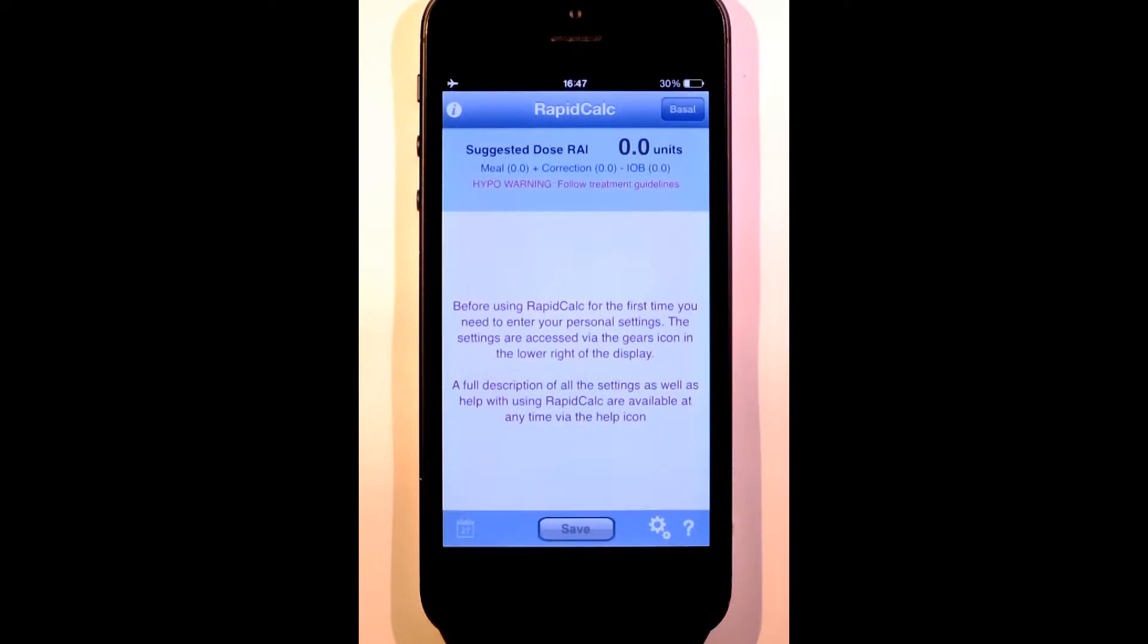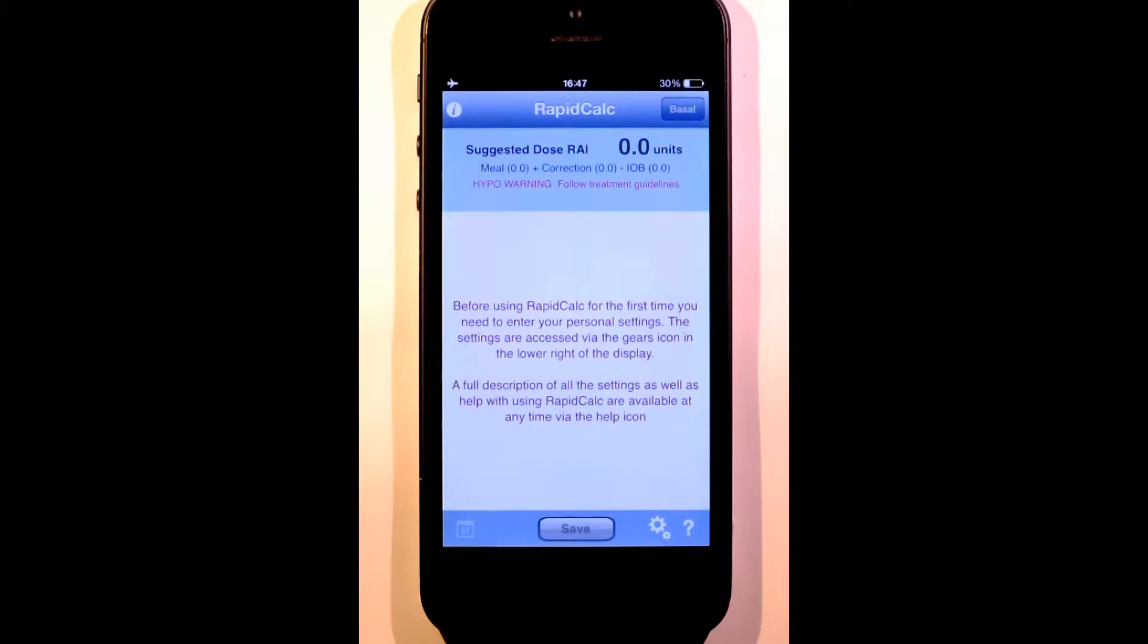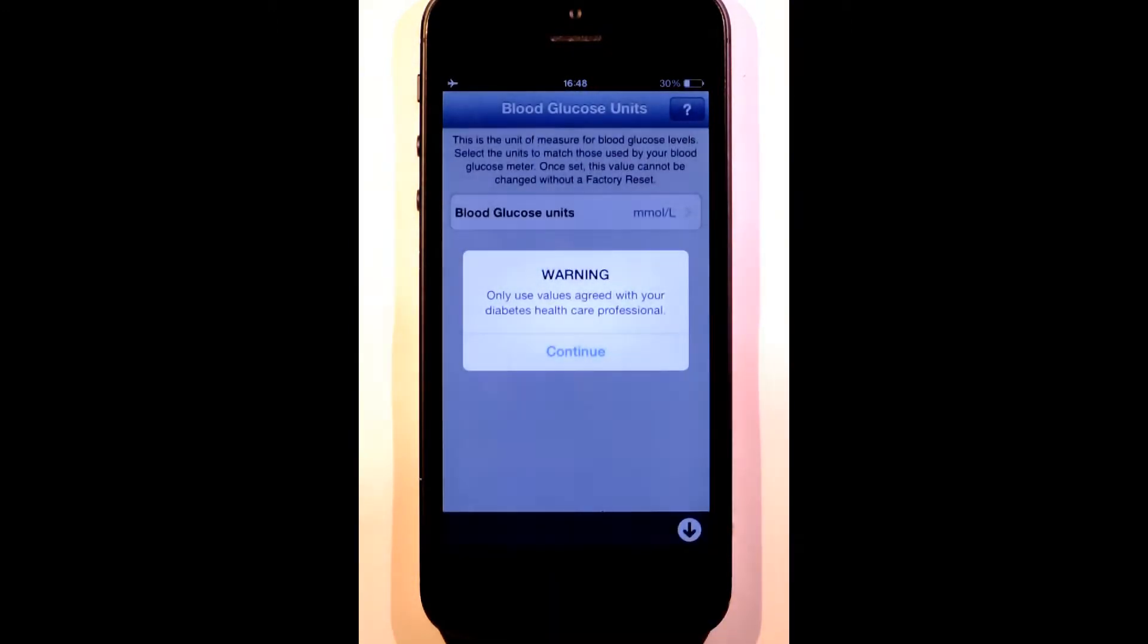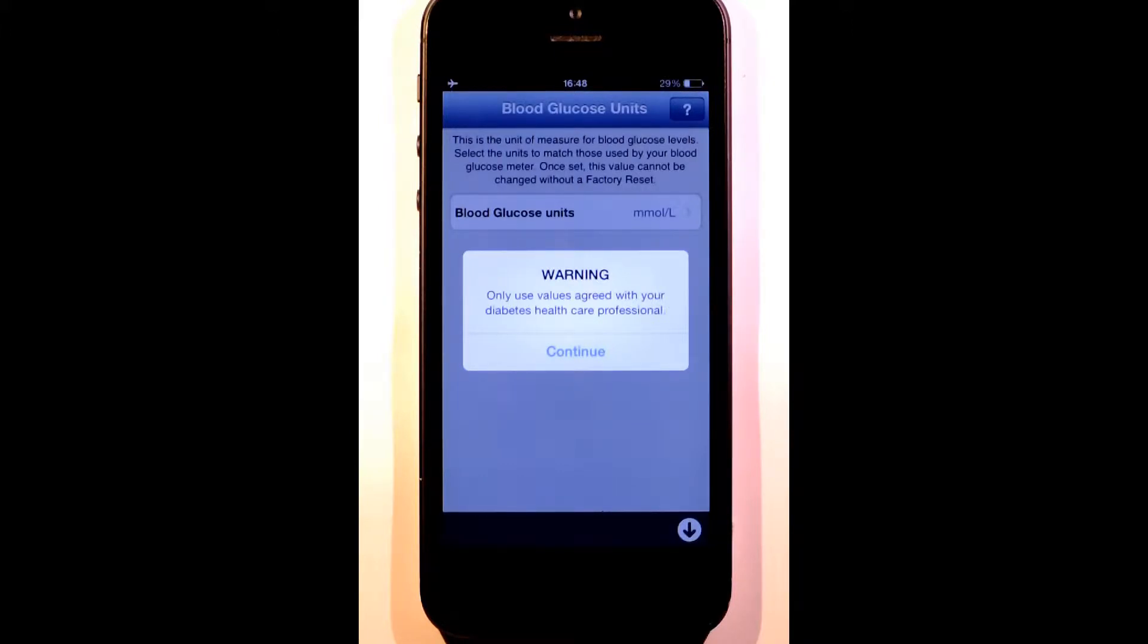When you open RapidCalc for the first time, the main screen looks like this. You can't start using RapidCalc until you've personalized it with your own targets, ratios, and other settings. We always advise that you work with your healthcare professional to set the right values for you.